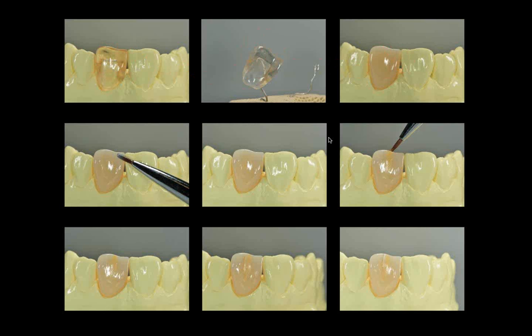Basically, the crown is finished. You don't have to bother. If you want to add stains, you can actually add stains like you see here, and do modifications. But usually, from canines backwards, you don't have to bother about stains.